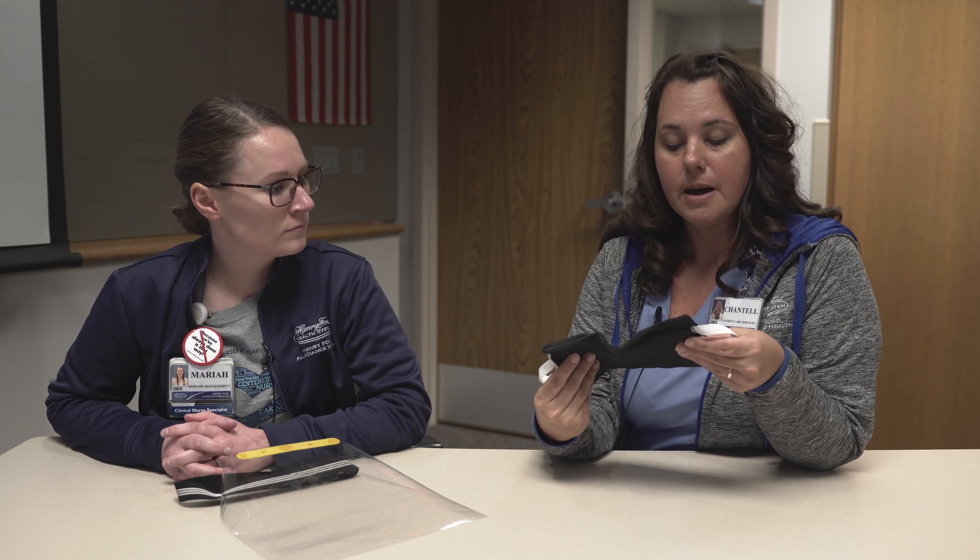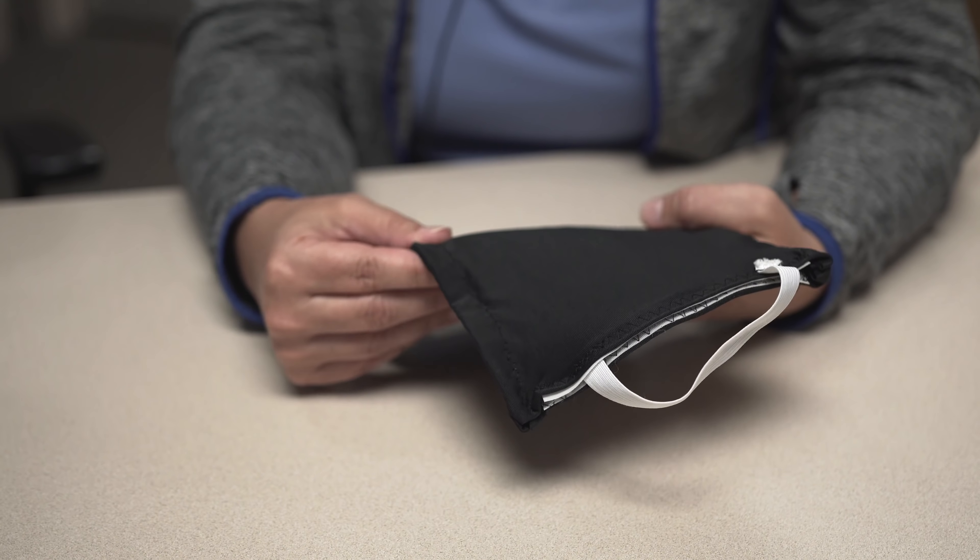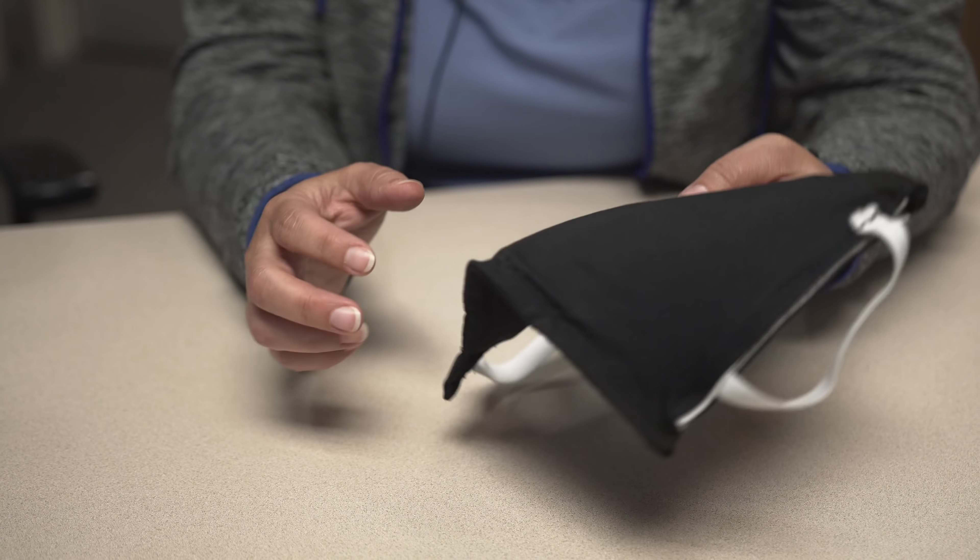We've come up with a mask and a face shield. These are both prototypes, so they won't necessarily look exactly like this when they're finished. The products we chose for the mask — the fabric is moisture wicking.